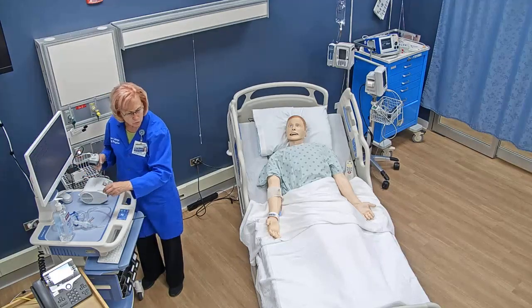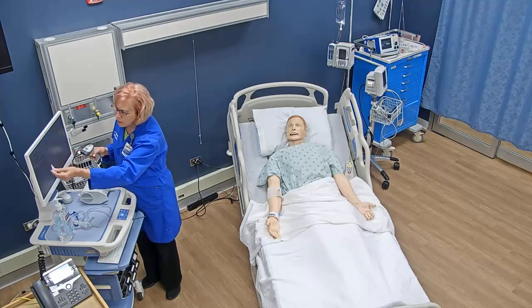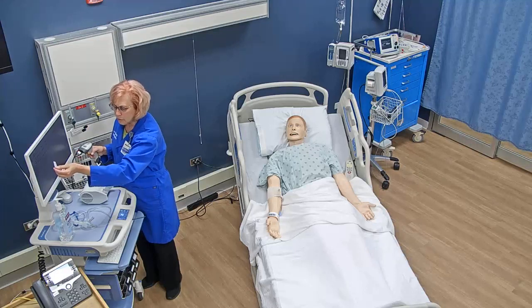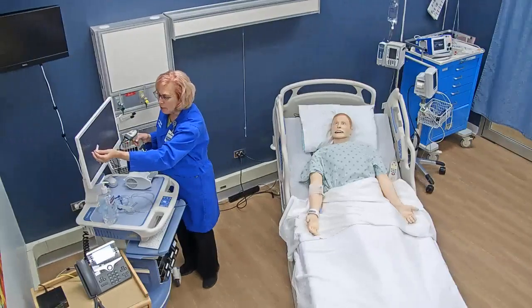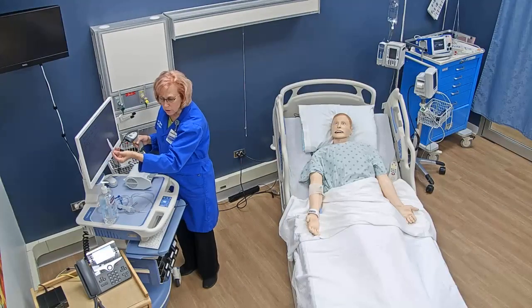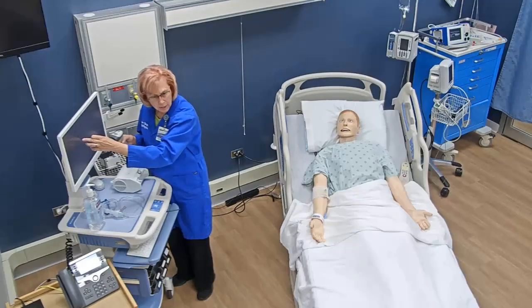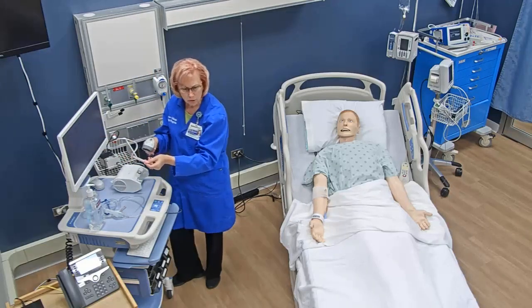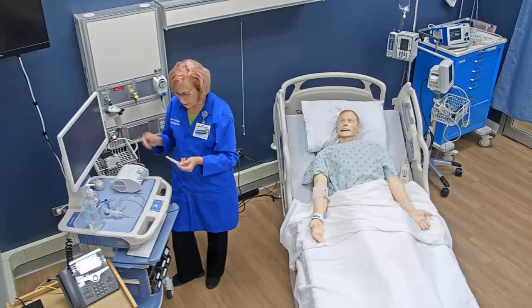Now I am going to check my medication. So I start with his name, DeAndre Williams, and the medication that I have is ipratropium bromide and albuterol sulfate. The doses are 0.5 milligrams and 3 milligrams in this 3 milliliter vial. He is going to get this 4 times a day, and right now he's going to get his 9 o'clock dose because it's 9 in the morning. I'm going to scan this medication. So now I have finished my 3rd check and I'm ready to administer the medication.